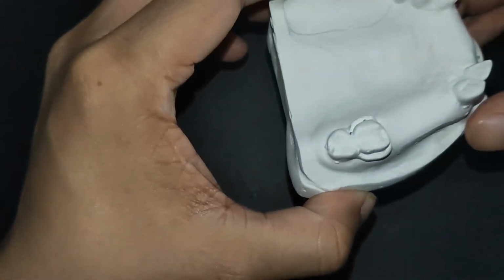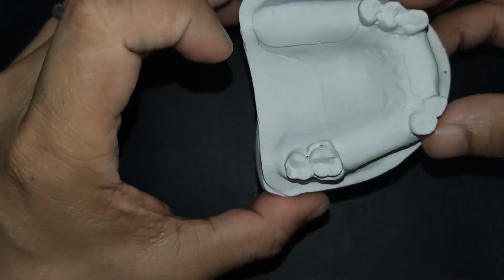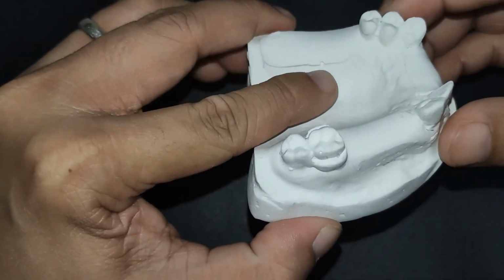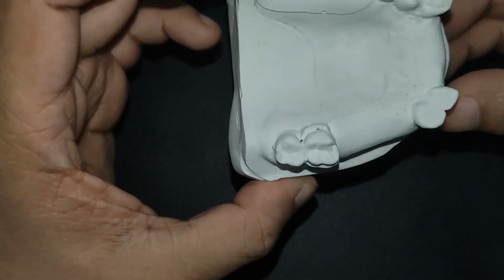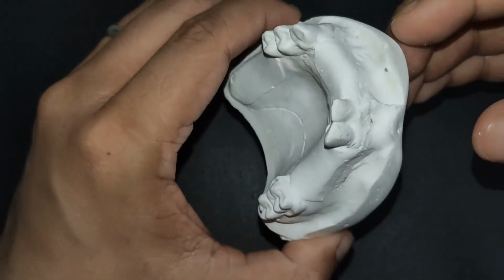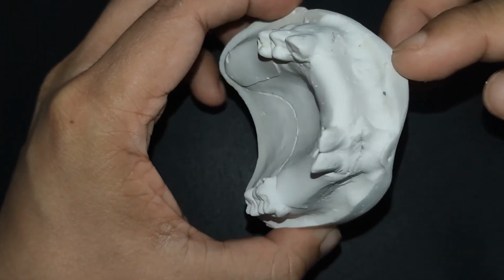Okay, now the upper is here. Okay, so the scoring was duplicated very well, and the finish lines are there. May mga konting porosities, but that's okay. Blockouts are visible, duplicated very well. Okay, so this is what we're going to expect after you've taken an impression of your cast. Okay, that's it.